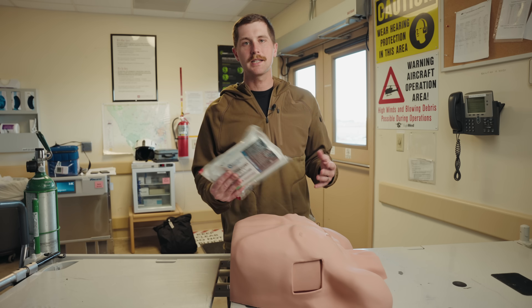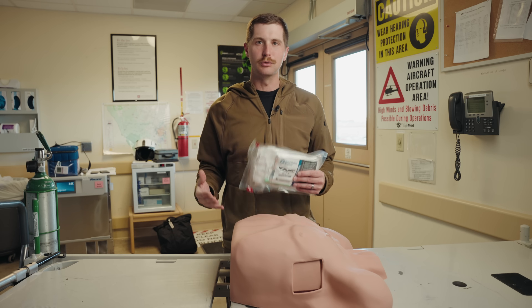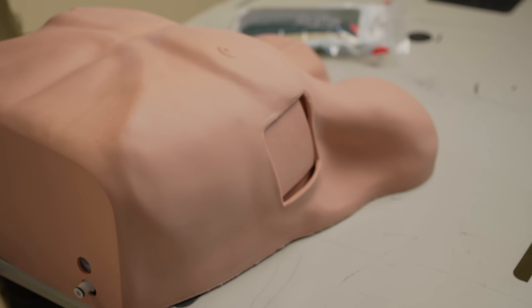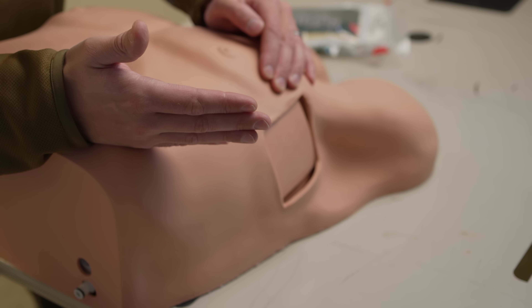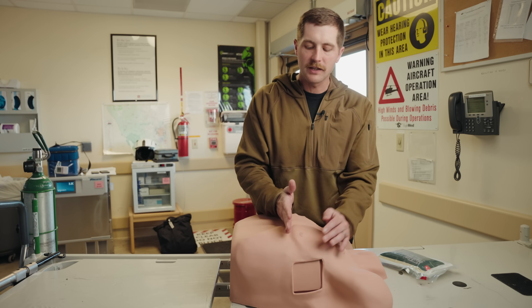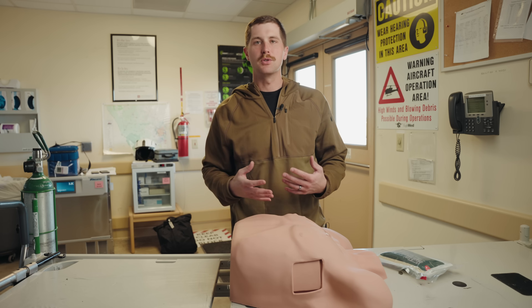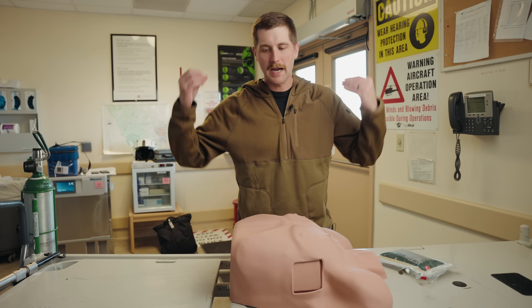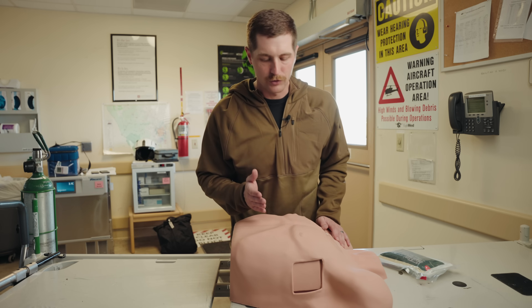You can get packaged kits that have everything you need, but these have a lot of stuff in them that you absolutely don't need. Let's talk about the site of this procedure. This procedure is going to be performed at the 4th or 5th intercostal space — you can see right here on this dummy where we're supposed to do it. As a rule of thumb, we don't want to go inferior to the inframammary fold, which is the crease of the breast. The nipple line has been used for many years, but the problem is that nipples vary — from the 80-year-old granny to the 25-year-old bodybuilder — so it's just not a very accurate landmark.